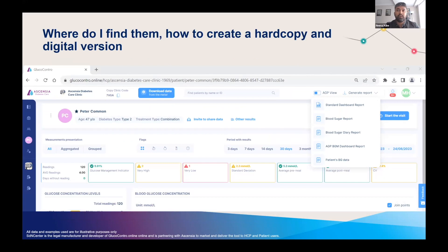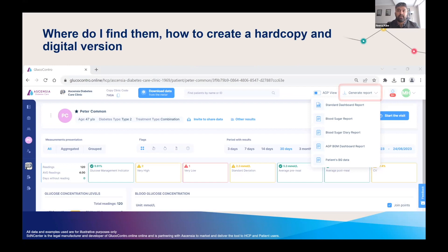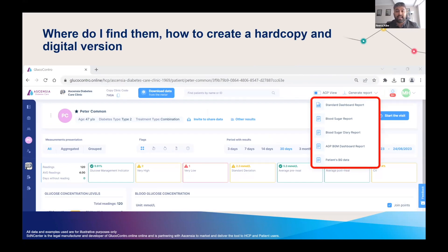So where can you find these reports in Glucocontro? When you're in a patient profile, you will see 'Generate Report' in the banner on the right-hand side. Clicking this will then drop down the option to select your desired report. It's that easy.